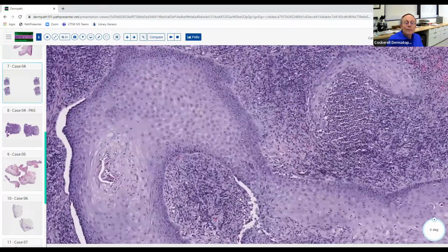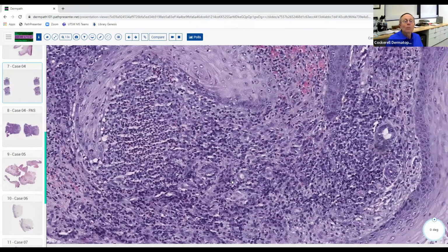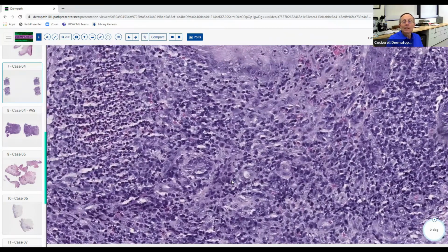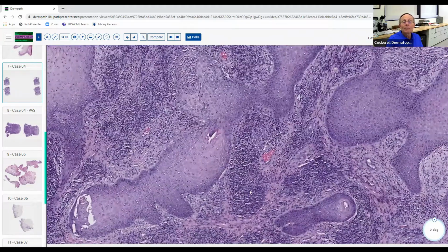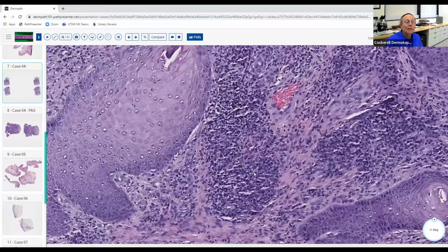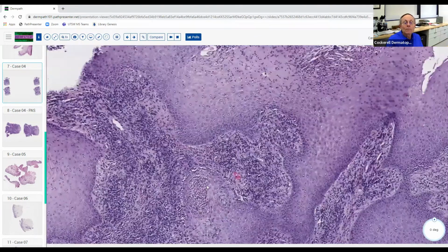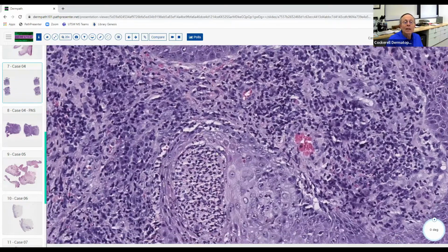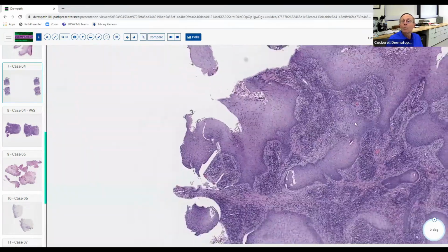And probably the one that's easiest to find is chromoblastomycosis with H&E, because obviously the organisms themselves have melanin and they're already colored for you, so you don't really have to stain them. Blasto's a little harder to see. I'm not really seeing any here that are just standing out. So I think if you go back and search the slide, you'll find some organisms in here.